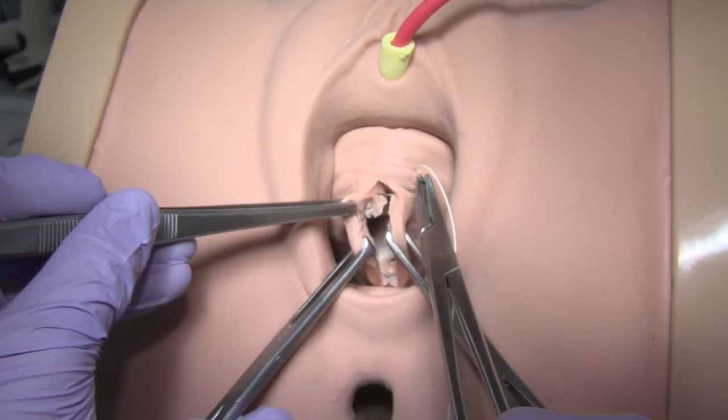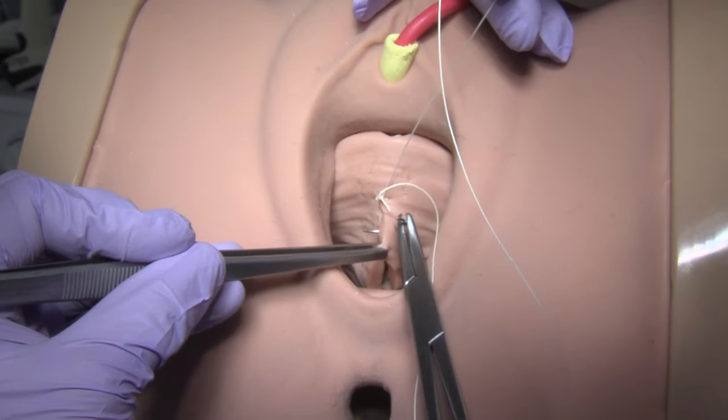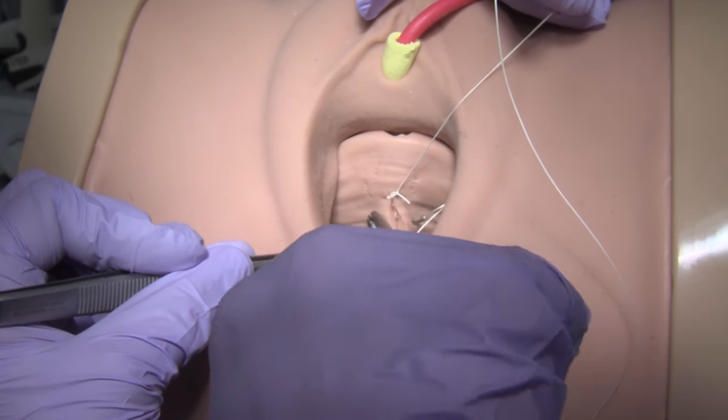Trim excess vaginal epithelium and re-approximate the vaginal epithelium with 2-0 or 3-0 delayed absorbable suture in interrupted, subcuticular, or running fashion.